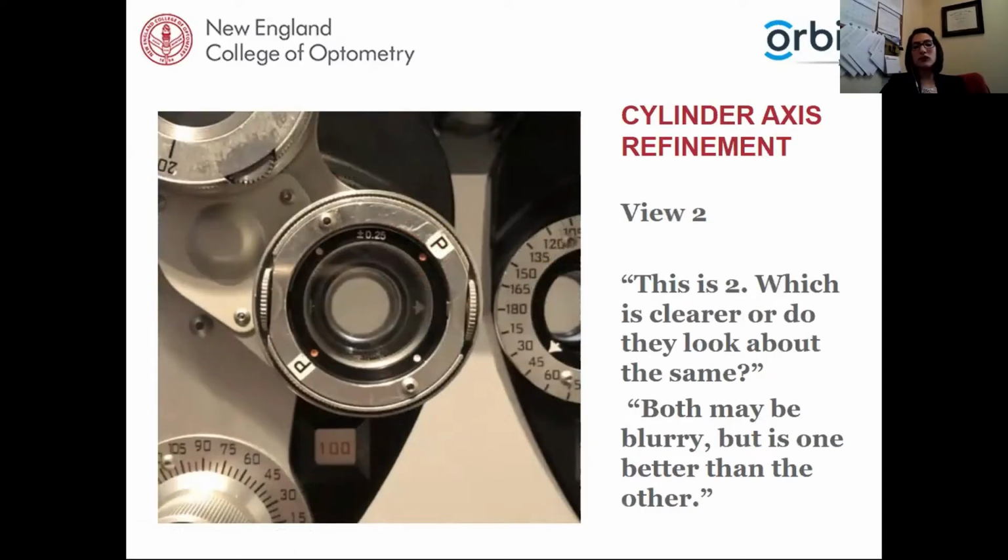So view 1, view 2, and I'll say which is clearer, or do they look about the same? And if your patient's hesitating, maybe they're not quite sure how to answer, you can also say, both views may be blurry, but is one better than the other? Because very often both may be a little bit blurry, but what we're trying to get after is one better than the other? Or are they equally blurry? And equally blurry is okay.